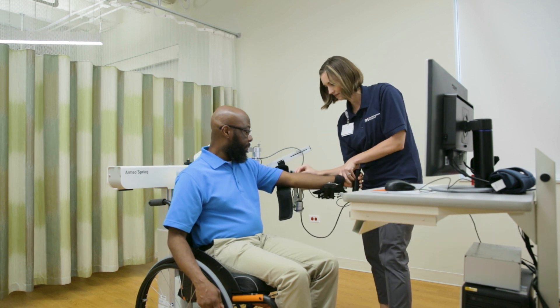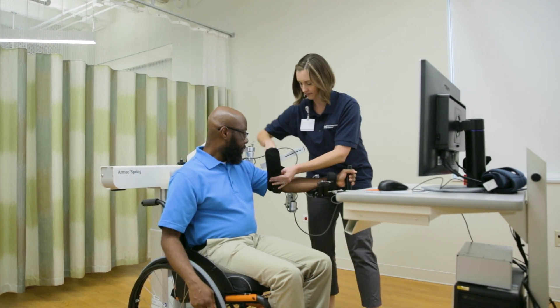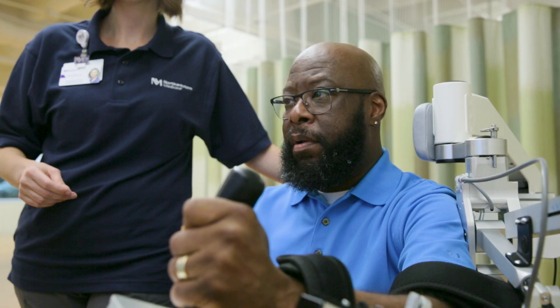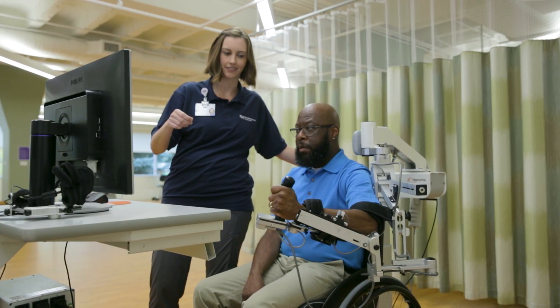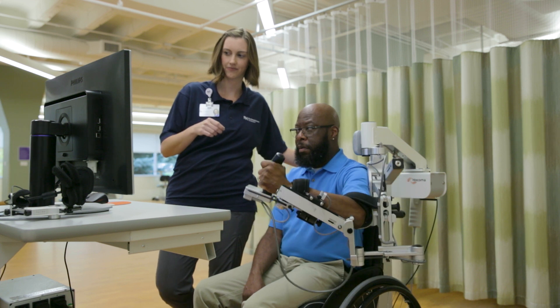The Armeo Spring uses skills that are functional, intensive, task-specific, and self-initiated to facilitate your arm and hand rehabilitation and recovery.